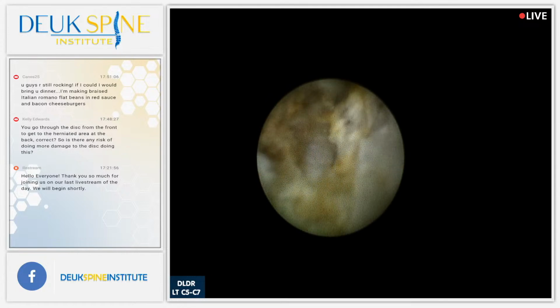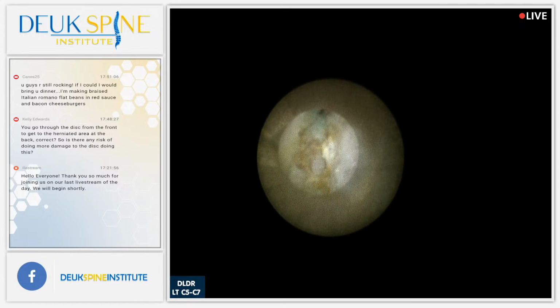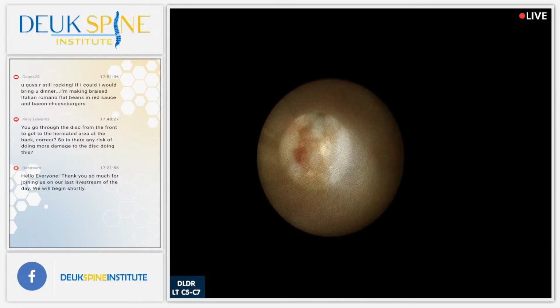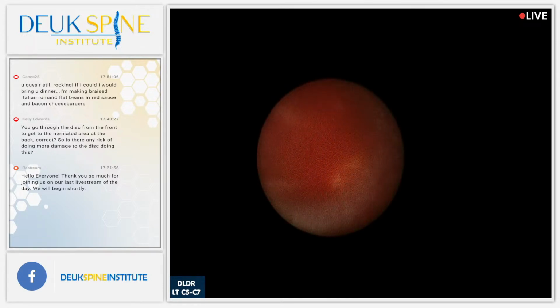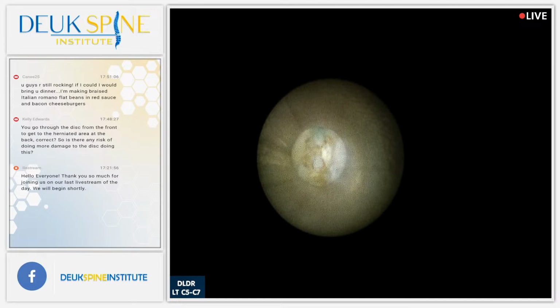You guys see the spinal cord right there? Underneath all that scar tissue? Yes, we do. All right, we don't want to damage that. We want to clean the rest of the herniation out. So we're just preparing the fiber. That's what happens when the irrigation goes off. Everything gets cloudy. You get a little bit of bleeding, but it's very minimal. Off, on. See what a difference irrigation makes? Pretty cool, huh? It becomes a red slushy without it. All right.